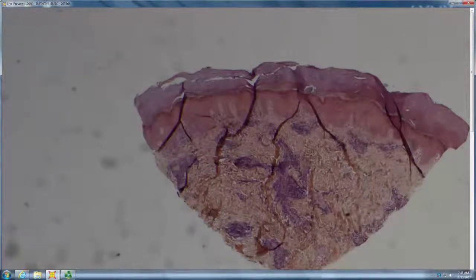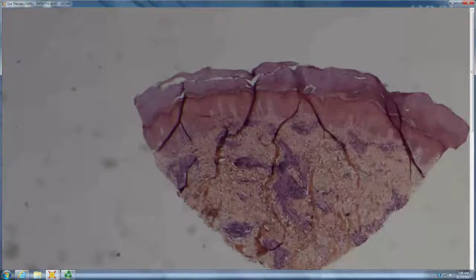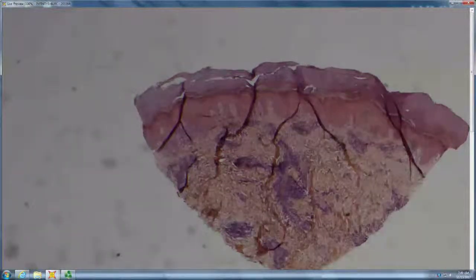Now this one though, it's got a little bit of interface change. See that little vacuole there? And it's got a little bit of spongiosis. So it can't decide what it wants to be. It's got a little sponge, it's got a little interface, it's got a little dermal. So what are the conditions you're supposed to think of when it can't decide what it wants to be? Drug, viral, syphilis. Drug, viral, syphilis for mixed patterns, right? And with all the dermal hypersensitivity response, probably drug. Very good.